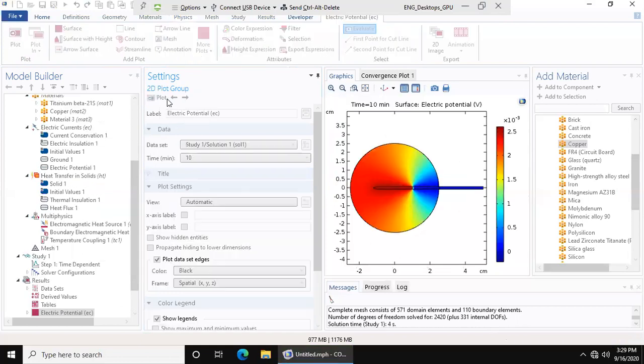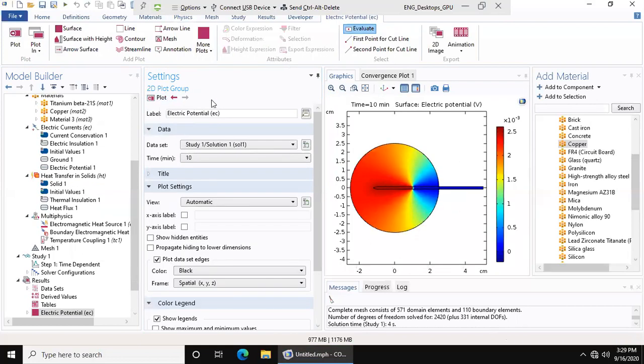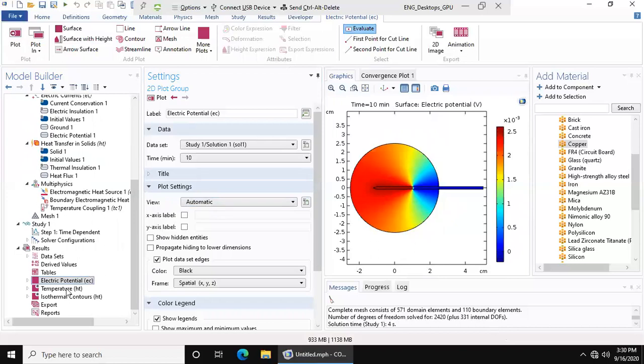And it's not going to take very long. First thing that we have is our electrical current. This electrical profile looks good. It has 2.5 millivolts constantly coming out of the probe throughout the entire profile. And the electrical profile is going to be the same, because the initial condition is for the probe to have 2.5 millivolts. But the thing is, we don't care about the electric potential, because 2.5 millivolts is nothing. It is not going to affect these cells in any way.